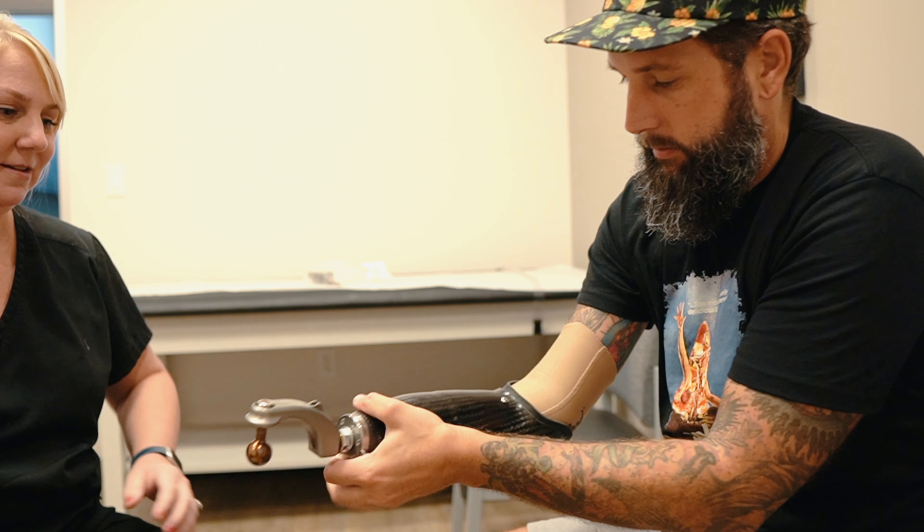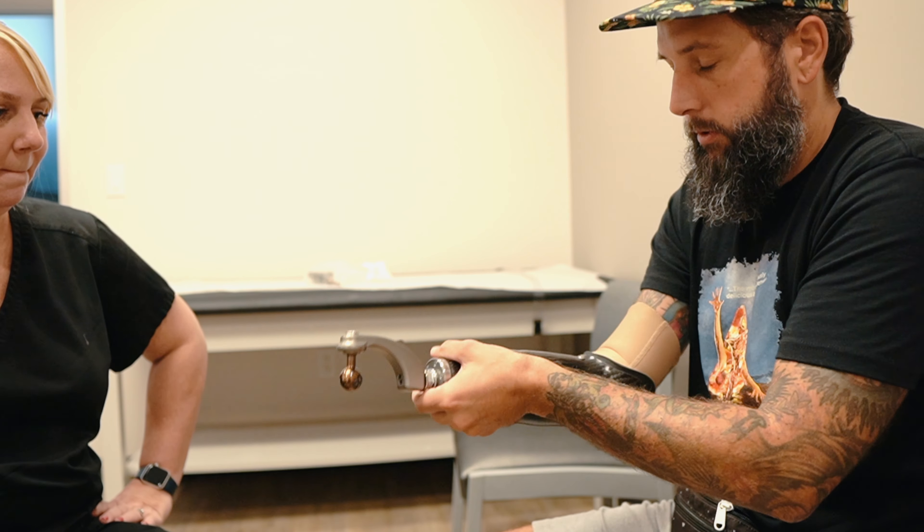Do you know what it takes to get a custom prosthetic arm for mountain biking? On this episode, I'll show you what it took to get mine.